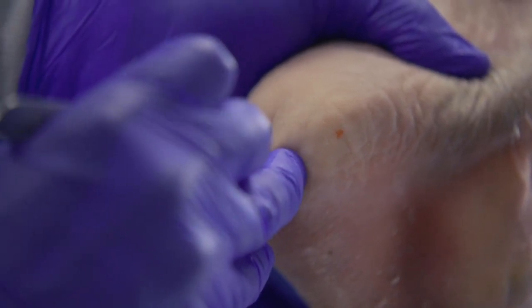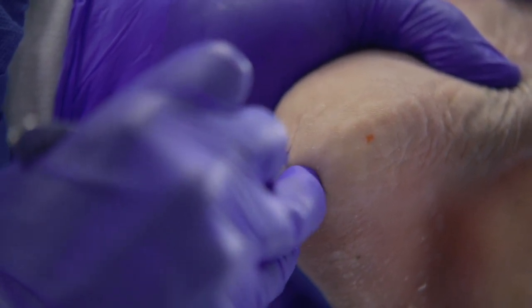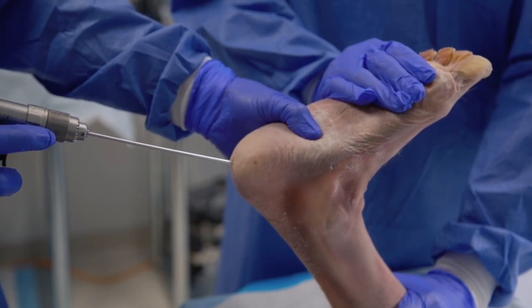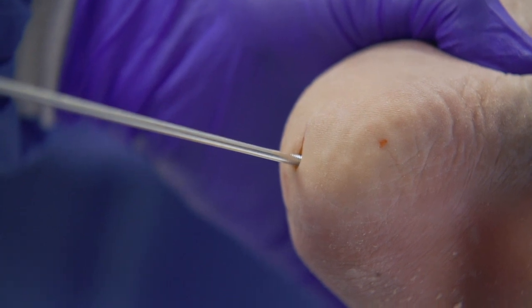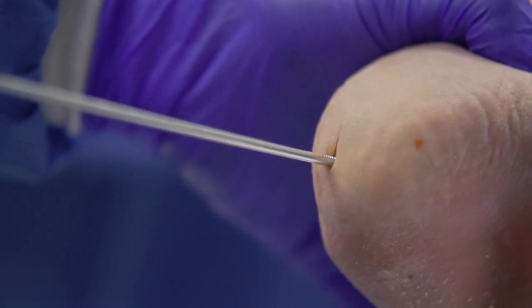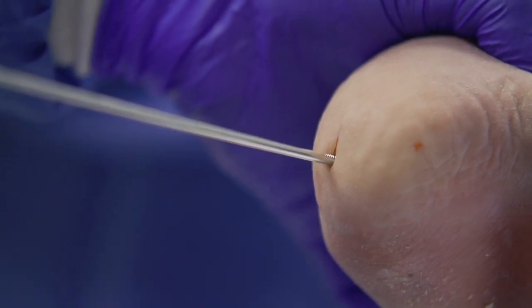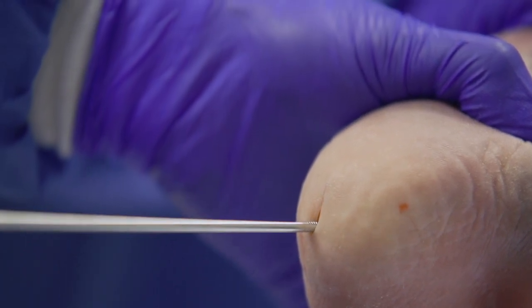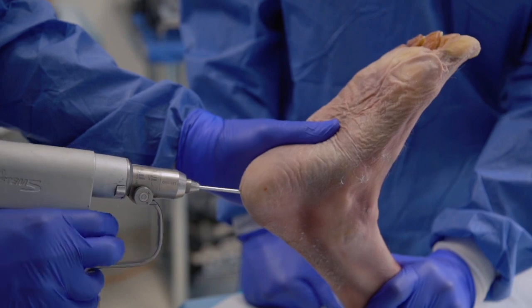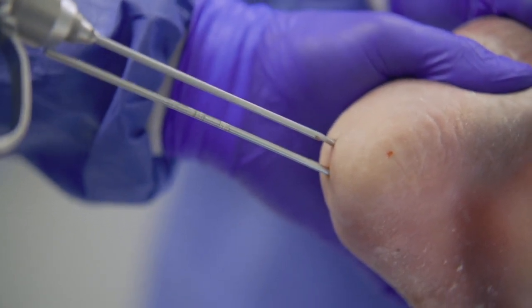One incision is made on the bottom of the heel, typically centered on the plantar surface, directly to bone, to aid in guide wire placement. The initial guide wire — the more posterior of the two — starts on the more posterior aspect of the incision, aimed up toward the talus and angled slightly medial, as the tuber is slightly lateral to the body of the talus. This ensures you do not miss the talus and end up in the lateral gutter, placed perpendicular to the arthrodesis site. The second wire is placed more anteriorly and directed slightly medial to the first guide wire.